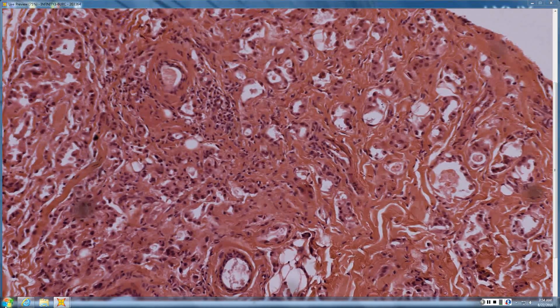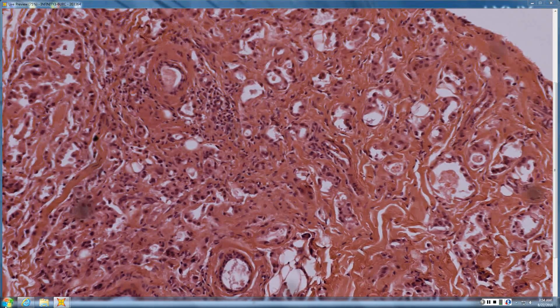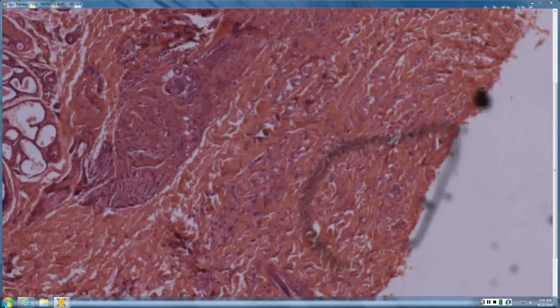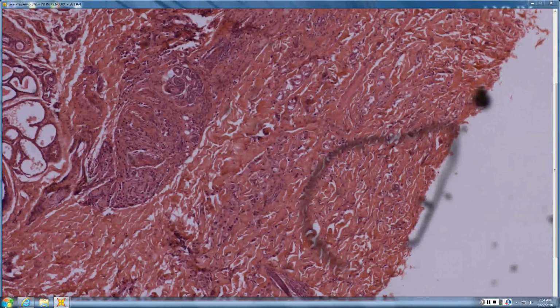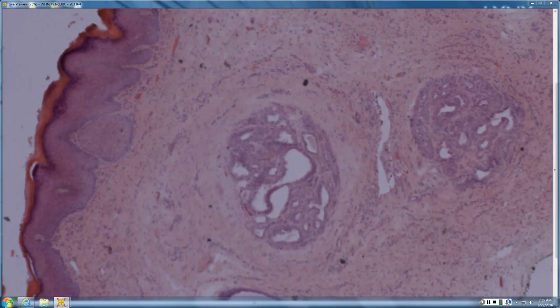I think we need some stain. Yeah, but there are two possibilities. One is it's a primary apocrine carcinoma, which can happen, which is what this turned out to be. The other is the tail of the breast goes up into the axilla. So this is either carcinoma of the axillary tail of the breast tissue, or it's a primary apocrine carcinoma. It almost doesn't matter because breast carcinoma is an apocrine carcinoma. So whether it's primary in the apocrine glands or whether it's primary breast, the behavior is pretty similar. Do stains help at all in this? Not really, because breast is apocrine. They stain pretty much the same.